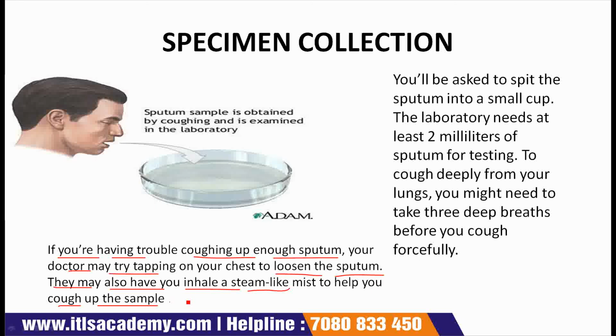Deep cough and collect sputum in a wide mouth sterile container. All expectorated sputum is contaminated to some degree with secretions of the oropharyngeal cavity, which contains a wide variety of commensal bacteria, some of which are potential pathogens of the lower respiratory tract.